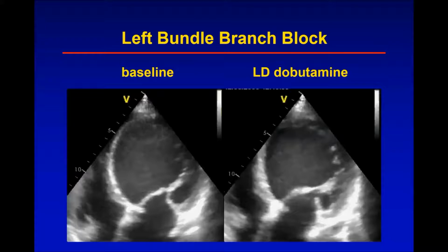So we have an uncoupling of myocardial function and performed work. So this global work assessment is not a good approach. We have to go local.